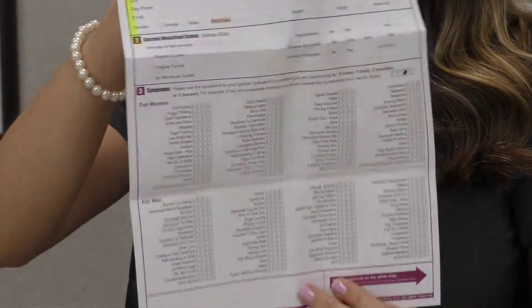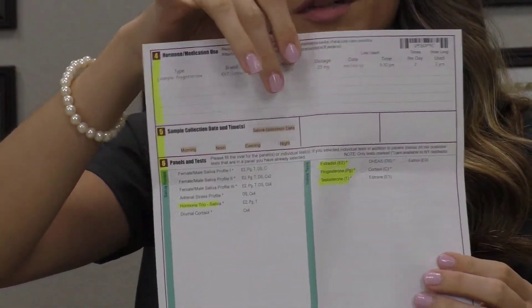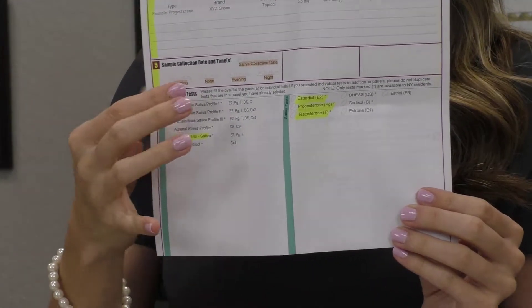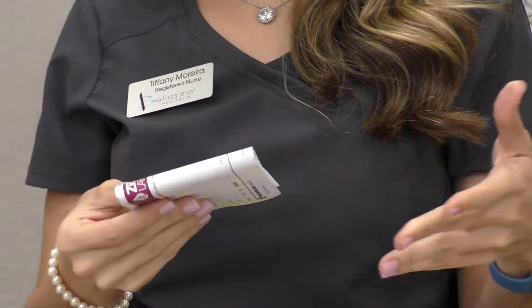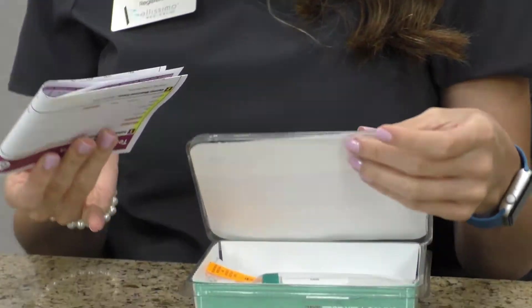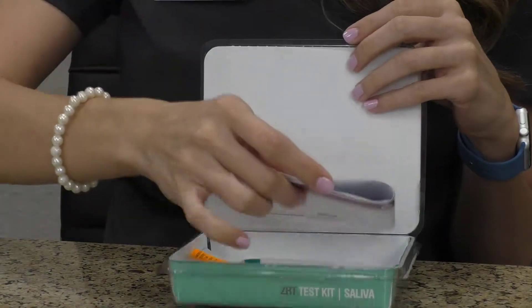We're also going to include our filled-out requisition form — that means the front of the form, and on the back we're going to have the hormones that we're taking, the time of our sample, and what we are testing. If we hand the kit to you or mail the kit, we will be pre-selecting the hormones that are being tested and we'll also write what you are currently taking to make it easier for you.